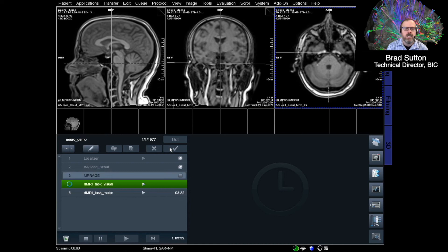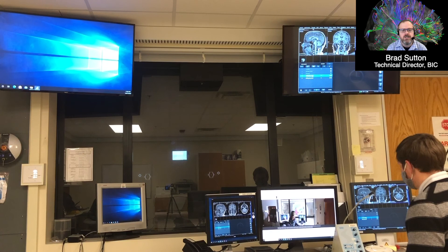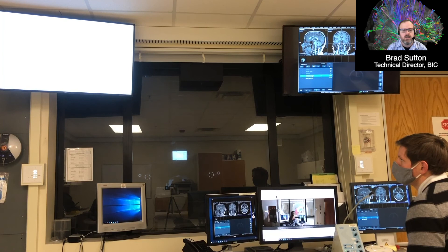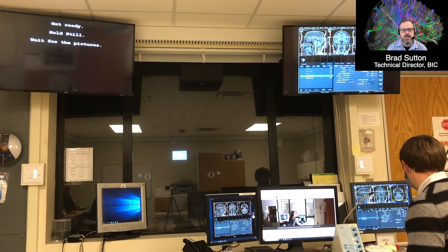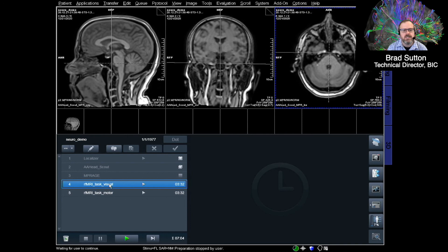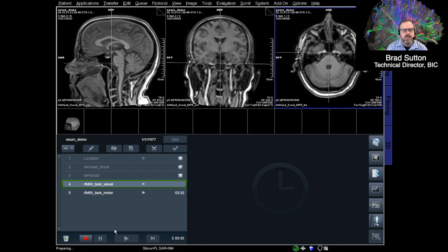The next two scans will be visual functional tasks. We're going to see what parts of the brain respond to a visual flashing checkerboard. The subject looks at the center of the screen as the checkerboard is displayed, and we take a picture every two seconds of all brain slices. We look for which parts of the brain increase their signal when the flashing checkerboard is on versus off, and we have to start the scan and the stimulus at the same time so we know which images align with the checkerboard.